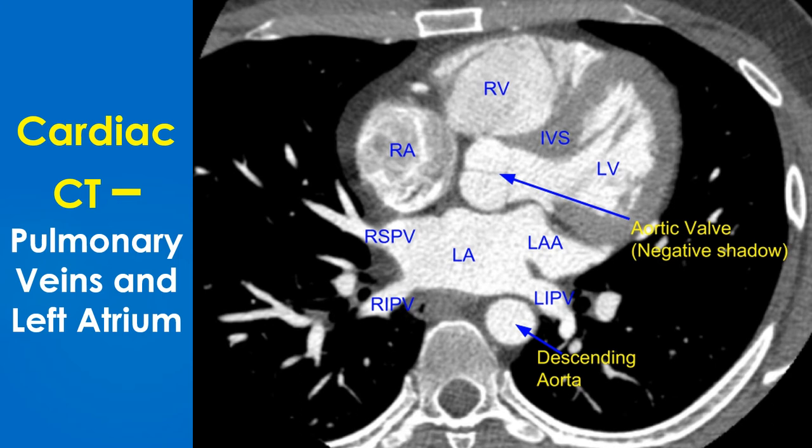In this image it can be appreciated that the right ventricle is an anterior chamber placed substernally, while the left ventricle has a more posterior location. Contrast density is greater in the left-sided chambers, as this is a delayed image acquired after intravenous contrast injection.